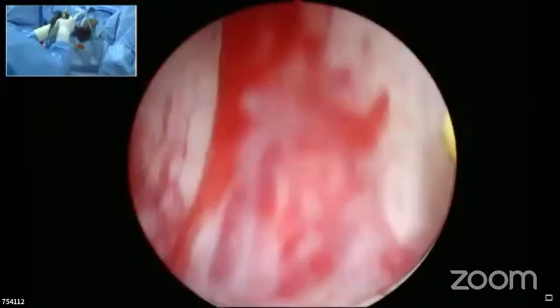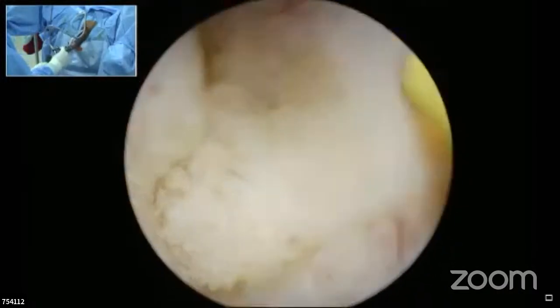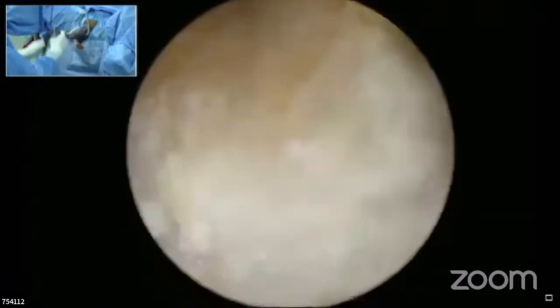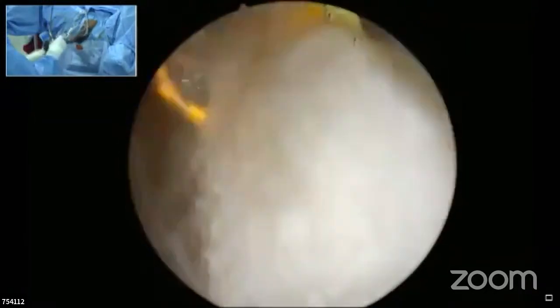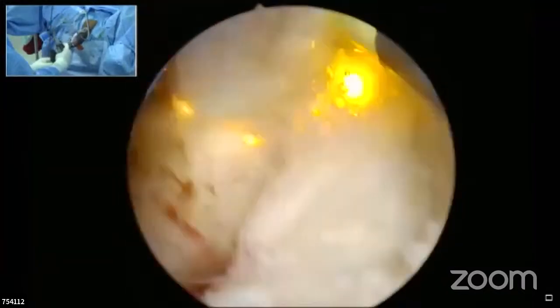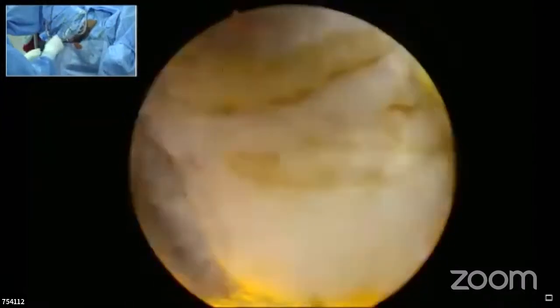I interrupted in between for my breakfast, now I've joined back. Regarding the venous bleeding, one of the techniques is to compress the vein proximally, and there you fulgurate it, not at the mouth where it is opening. Try that, it may work, may not work. And finally, if it is genuine venous bleeding, then if you have some work to be finished in 5-10 minutes, you can finish it up fast and put a traction. That is the only answer.